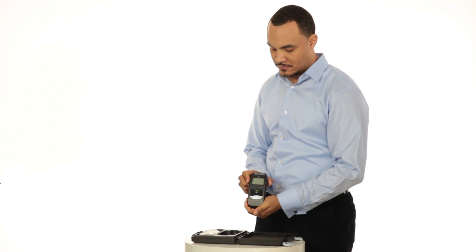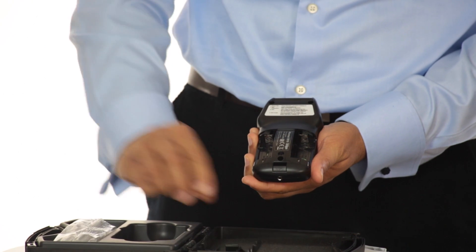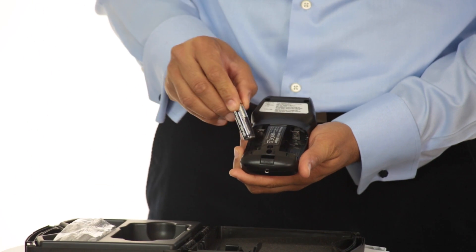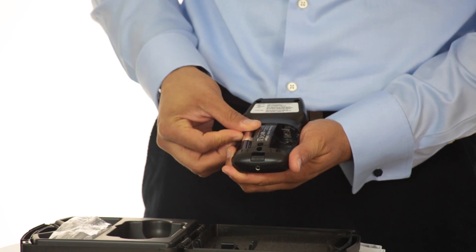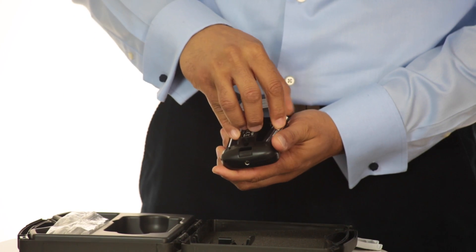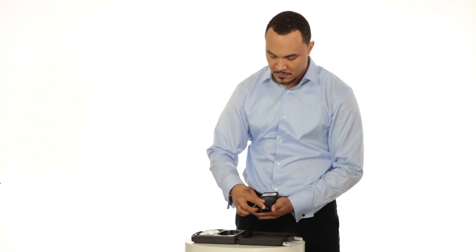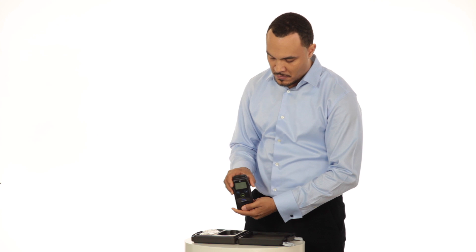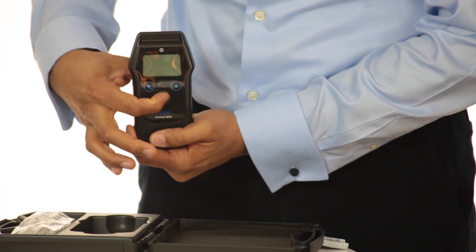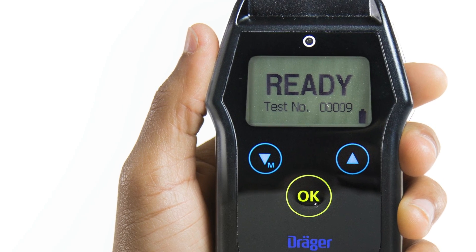Before you operate the device, insert the batteries into the battery compartment, which is located on the lower back of the device. To open the battery compartment, press in on the lock tab and remove the cover. Insert the two new AA batteries positive side up, then snap the battery cover back into place. To verify battery power, press and hold down the OK button for three seconds. A battery symbol will appear in the lower right-hand corner of the screen.